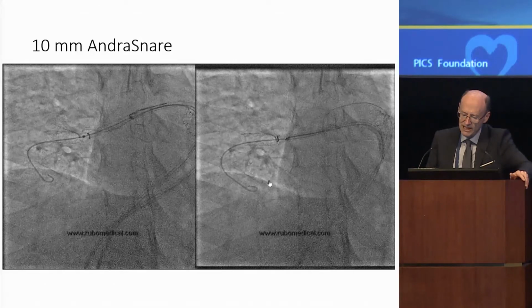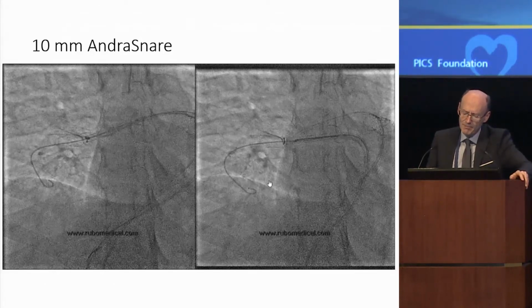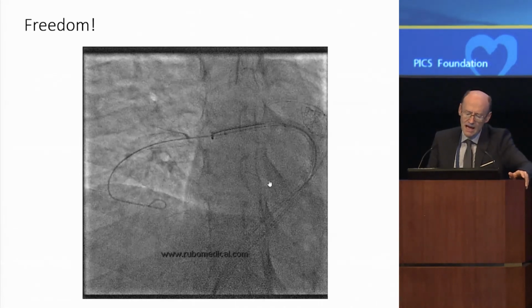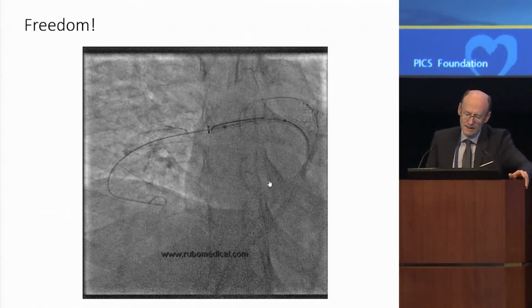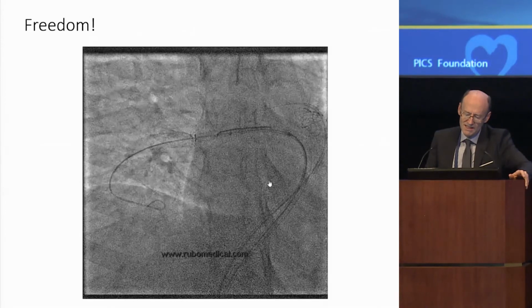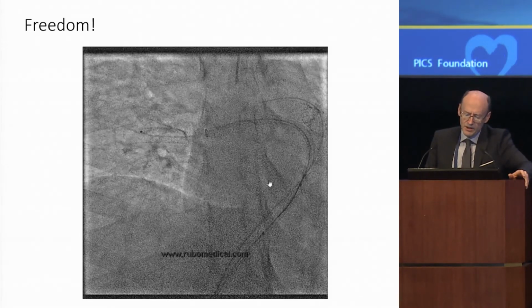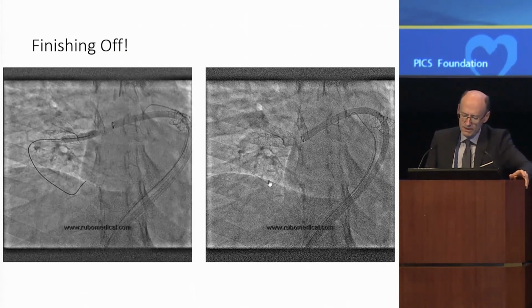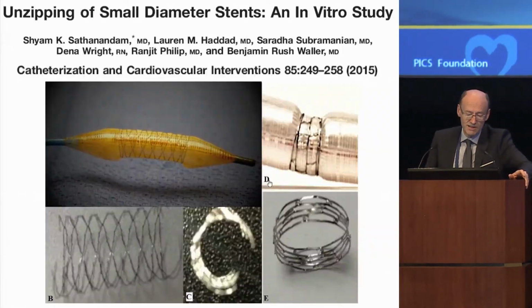And here eventually it gives. But you can see when you get this sort of umbrella type rupture in the balloon, where you get an umbrella forming distally. So we're able to get it out there. The stent isn't going to come, and there we're free. And then you need to finish off with the dilation, but maybe more cautiously to get it open. And you've got some flow into there. It's not ideal, but there's a limit with the cells you have.